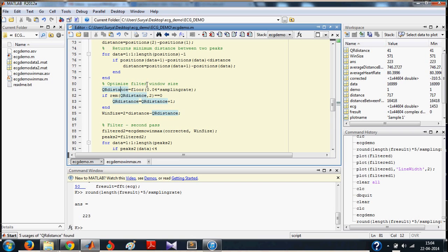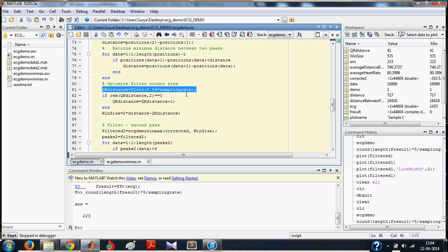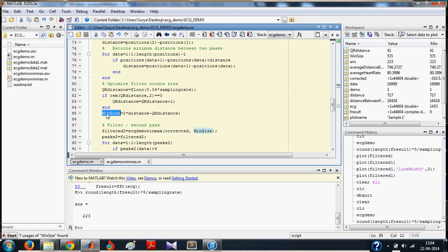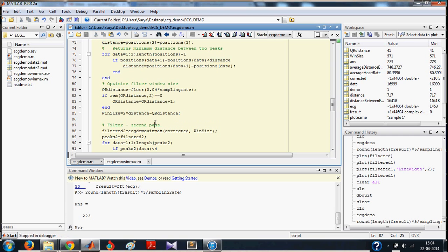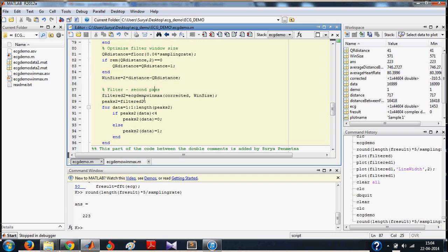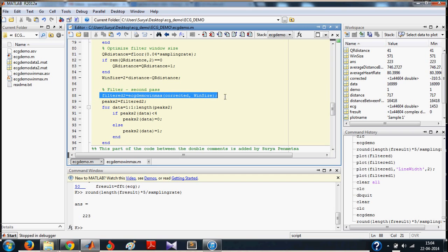And then, now you optimize the filter window size. You take this variable called QR distance. You do the same thing here. And then, you take the optimized window size as 2 times minimum distance between peaks minus QR distance. You repeat the algorithm again for detecting the peaks with the corrected window size.